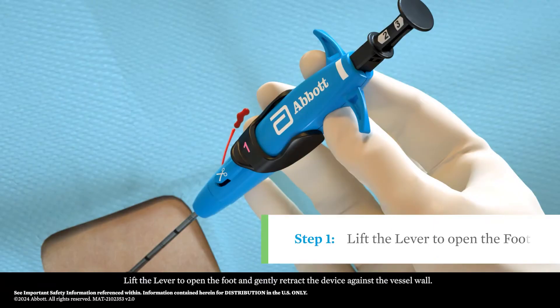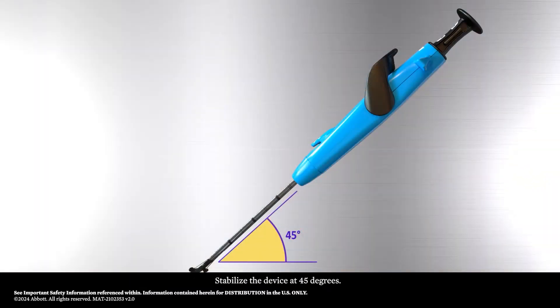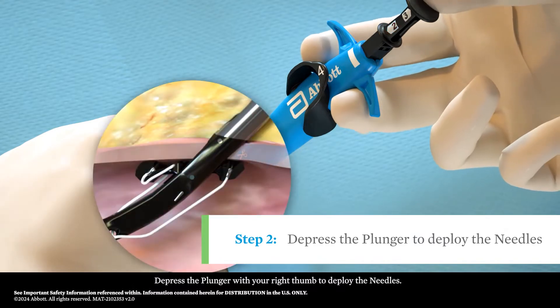Lift the lever to open the foot and gently retract the device against the vessel wall. Stabilize the device at 45 degrees. Depress the plunger with your right thumb to deploy the needles.